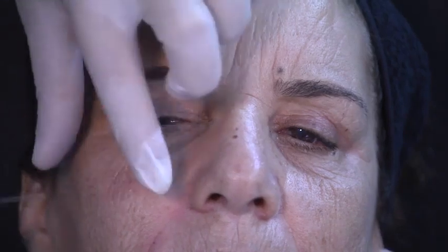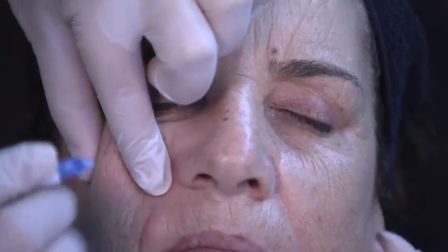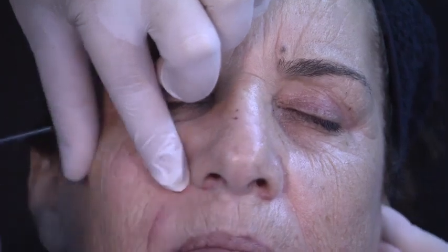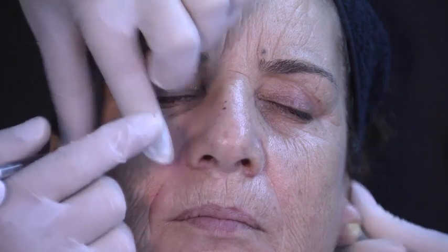I will not do it in the same session. I confirm in 15 days that everything is okay, there's no water retention, no lymphatic drainage obstruction, nothing. But now she comes back and she says, "Doctor, I like it, but I need a little bit more." This is what all our patients tell us, right? That's true. So I have my Vital Light, look at the clicker, okay?